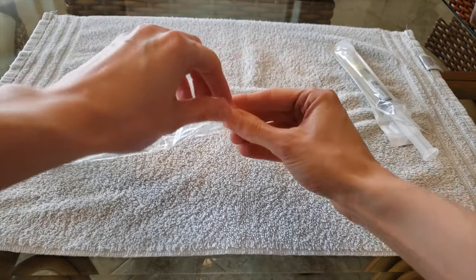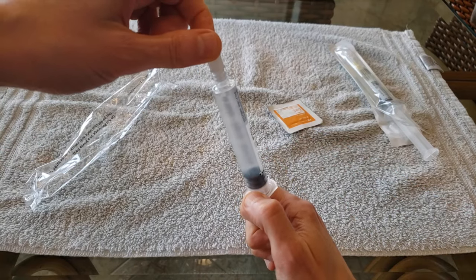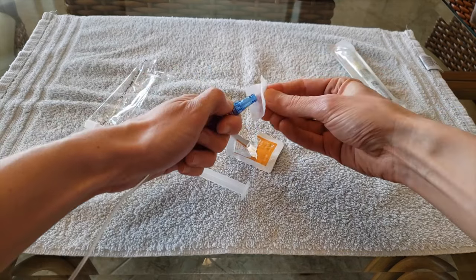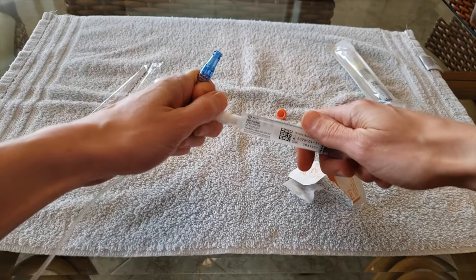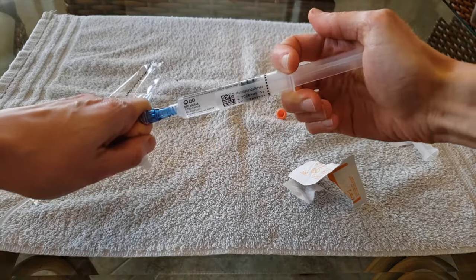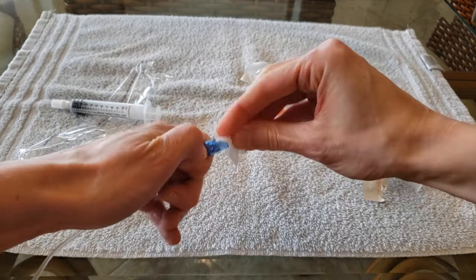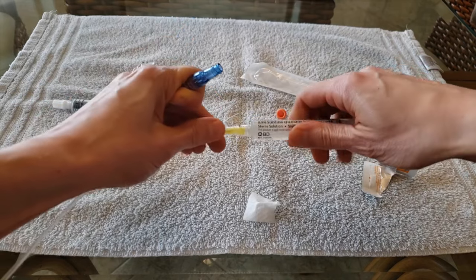To infuse the antibiotic into my intravenous line, I open a saline flush, loosen the cap, break the airlock, and tighten the cap. I then open an alcohol wipe. Next, I unscrew the alcohol cap on the end of my IV line and clean the end of my IV line with the alcohol wipe. I twist off the cap on the saline flush and infuse the saline flush. Next, I wipe off the end of the IV line with the alcohol wipe. I then disconnect the needle from the antibiotic syringe and attach the syringe to the IV line.